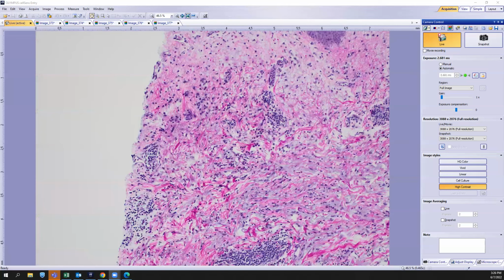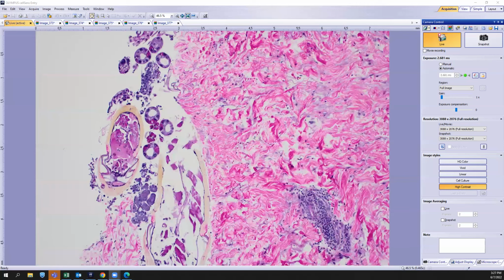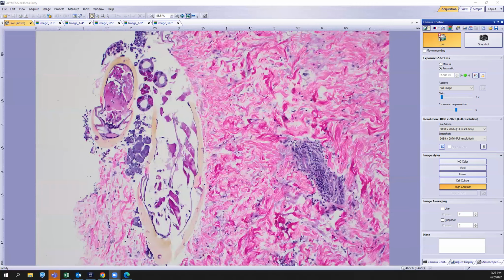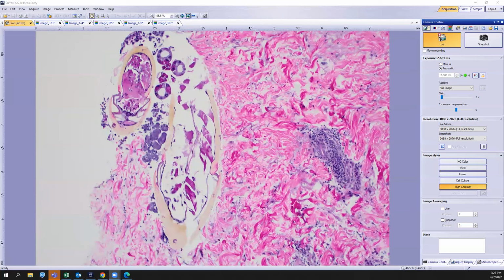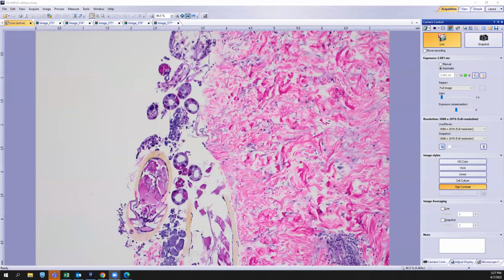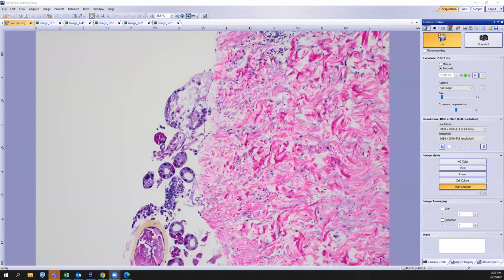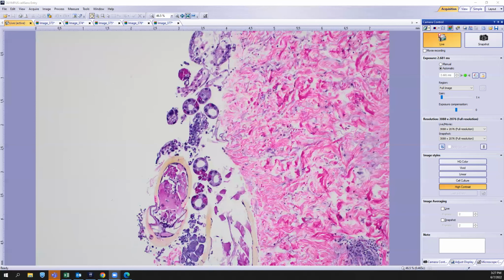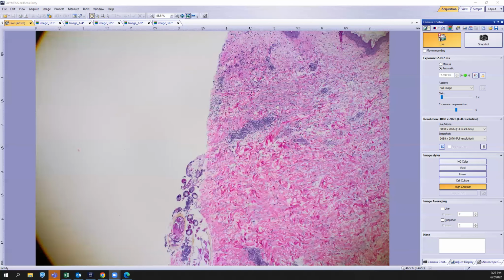But interestingly, in this specimen, we also have something over here to the adjacent peripheral side of the skin. Here you can see what appear to be tick parts. And so this looks like the mouth part of a tick embedded in the actual dermis here. And you can see a really nice overlying connection of the tick in the body, the inner part of the organs of the tick as well. So this is actually a tick bite that we biopsied off the patient.